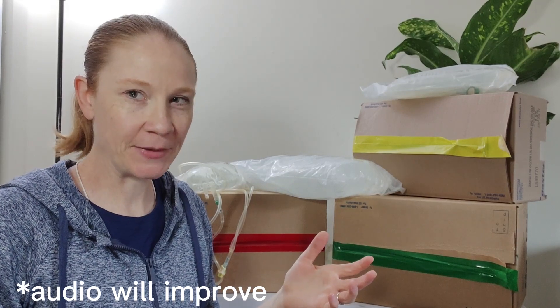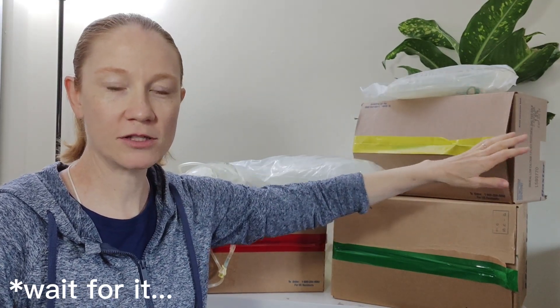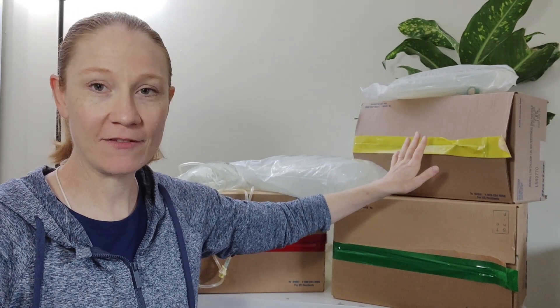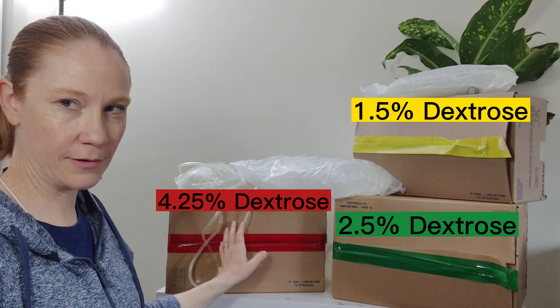When you receive your shipment of peritoneal dialysis supplies, not only is the percentage of dextrose and the size of bags written on the box, but they're also taped with the percentage of dextrose coordinating color. You can see here we have a box of yellows, here's a box of green which is the regular strength, and here's a box with the red.